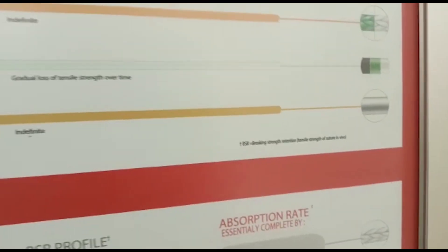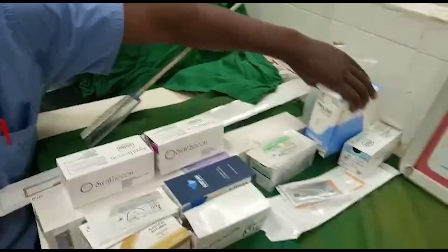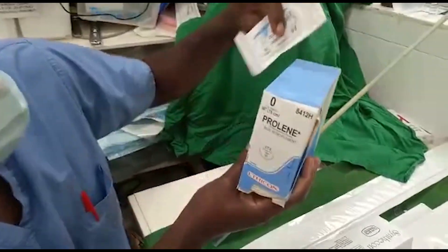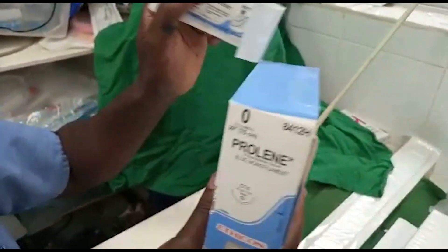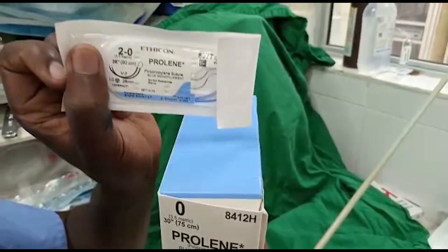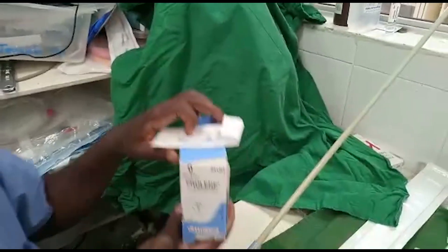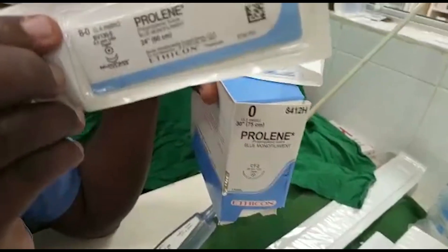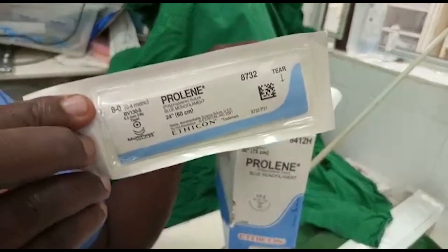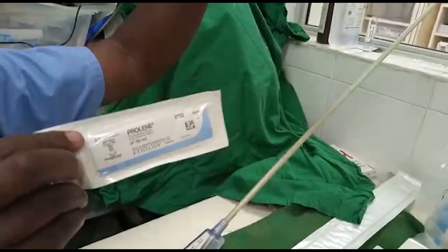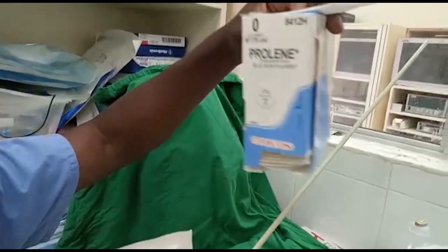Here are some physical examples of sutures. These are Prolene sutures in different sizes: we have zero, two-zero, and eight-zero. Looking at them, eight-zero is the smallest and zero is the largest in Prolene sutures.